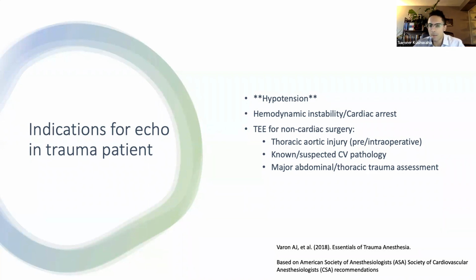In patients who are hemodynamically unstable but haven't yet arrested, it's very useful for looking into the cause of their undifferentiated shock, which we'll talk about more later on in the presentation. And transesophageal echo is also a very useful modality for cardiac surgery and for non-cardiac surgery. It can be used in the intraoperative setting for hemodynamic and structural assessments. It can be used in patients who have a suspected or known thoracic aortic dissection or other cardiovascular pathology. And it can also be used intraoperatively and postoperatively to assess the quality and positioning of aortic repairs.